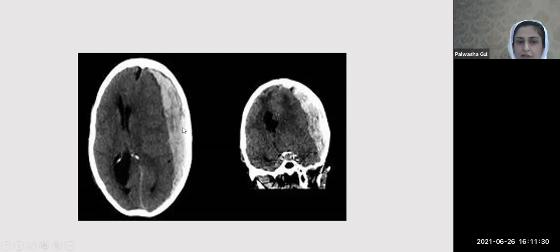The brain, under pressure due to the subdural hematoma as well as the edema, is going to come out, because it is trying to create a space for itself. So there is going to be a large extracranial herniation in the patient. And even the neurosurgeon would be thinking, what went wrong? I wanted to decompress the brain, but I don't know what went wrong.